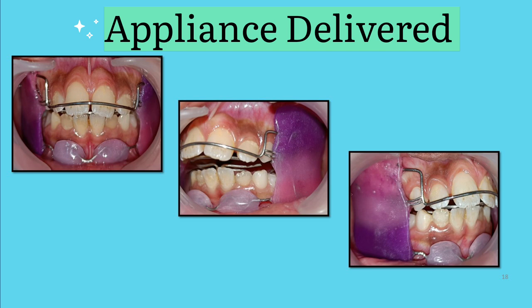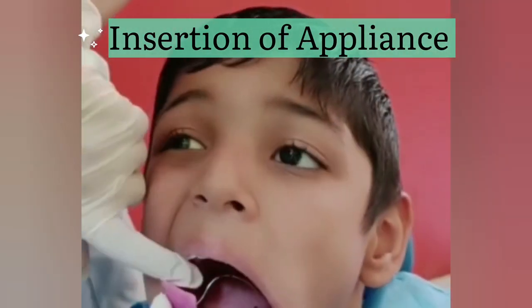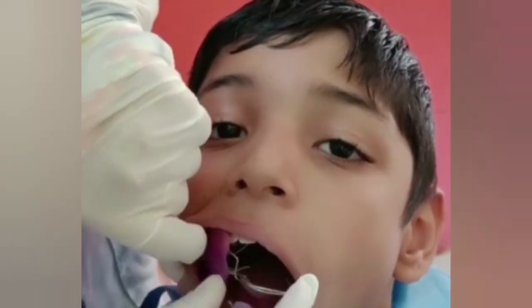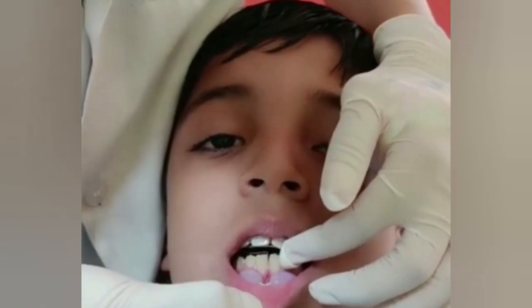After fabrication was completed, the appliance was delivered to a patient in the Department of Pediatric and Preventive Dentistry of Nursing Bhai Patel Dental College and Hospital, Krishnanagar. The cheek is retracted and then the appliance is slid into the mouth, completing the insertion.